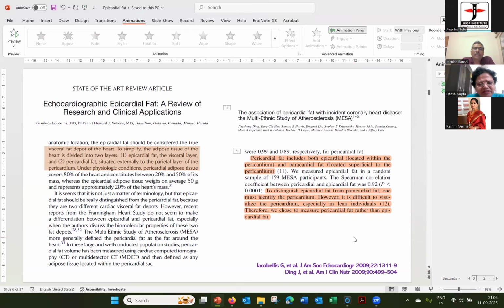The moment you adjust your gains and modify your views, it will come out as, oh God, what is this? This is a huge epicardial fat. Correct. So distinguishing it from pericardial effusion will not be that difficult, because pericardial effusion is just fluid, unless it is a hemopericardium, water. So it has a completely different echo density.